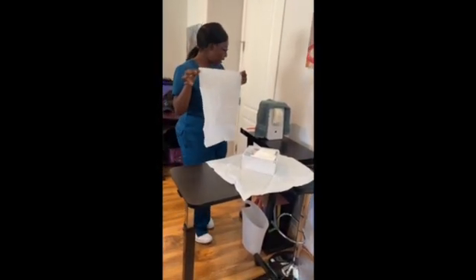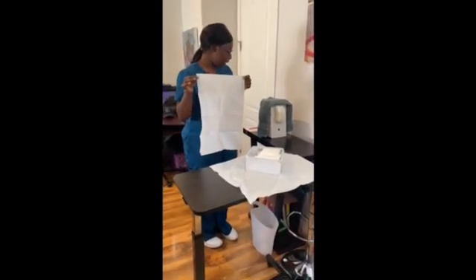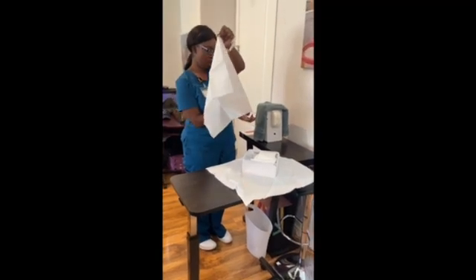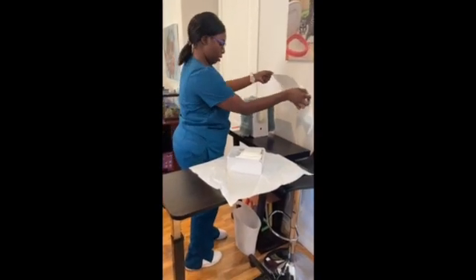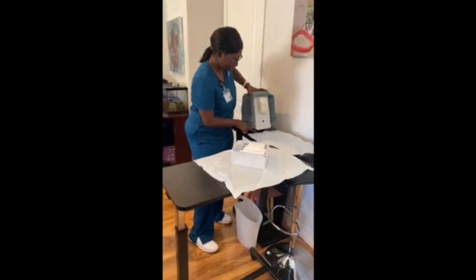Okay, Mrs. Taylor, I'm just going to have you raise up your legs, and then this is going to go underneath you. So patient raises her legs and buttocks when lifting hips, and that is placed underneath patient.